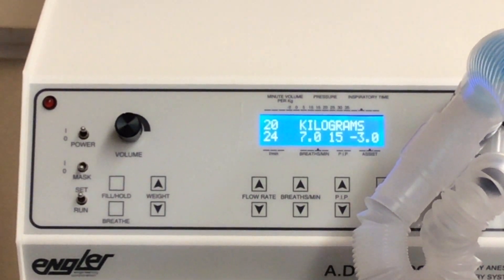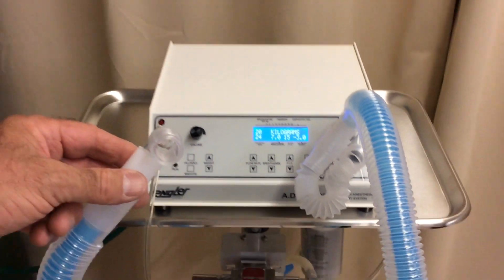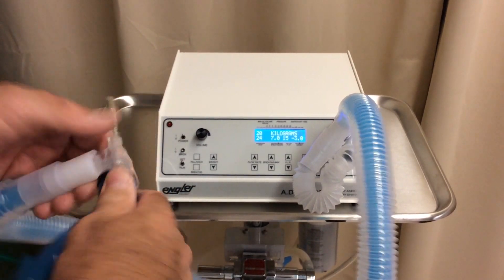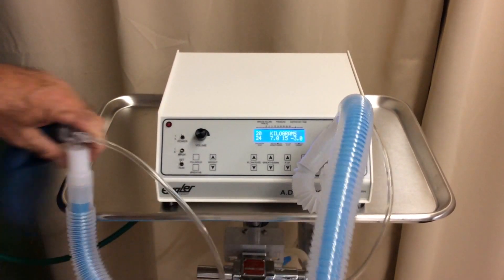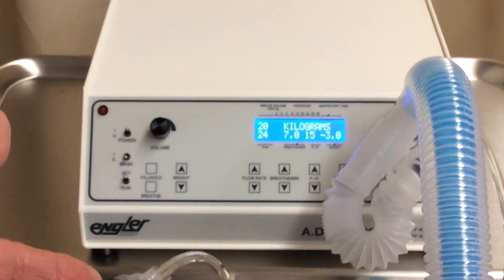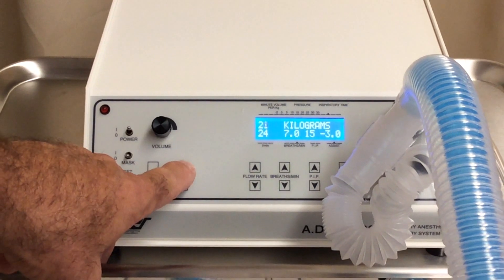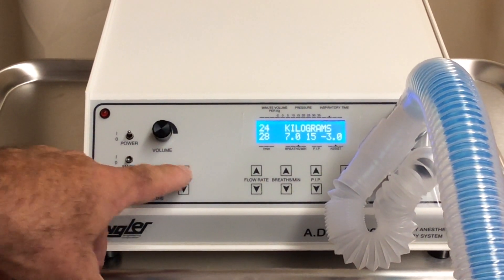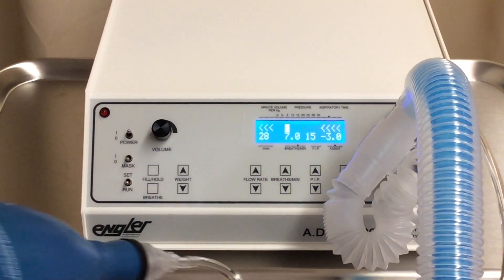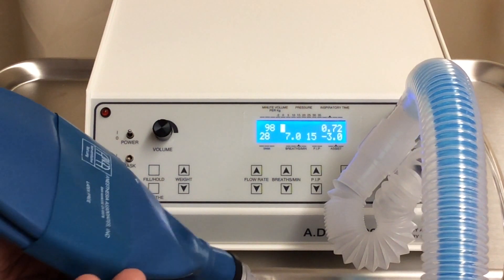Now we connect our intubated patient — in this case, our intubated patient is a test lung. We have to set the weight, and we do this by just pushing a button, either the up or down. In this case, we're going to push up to go to 24 kilograms for this patient and turn it on. We are now ventilating and delivering anesthesia to our patient.